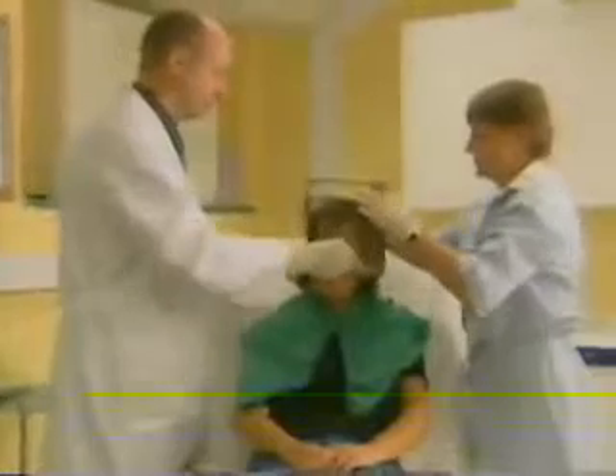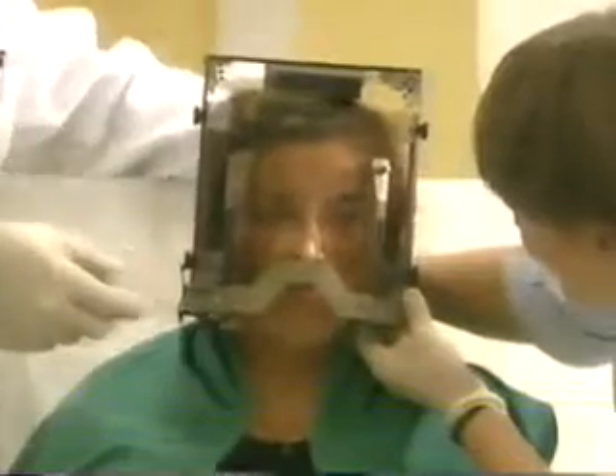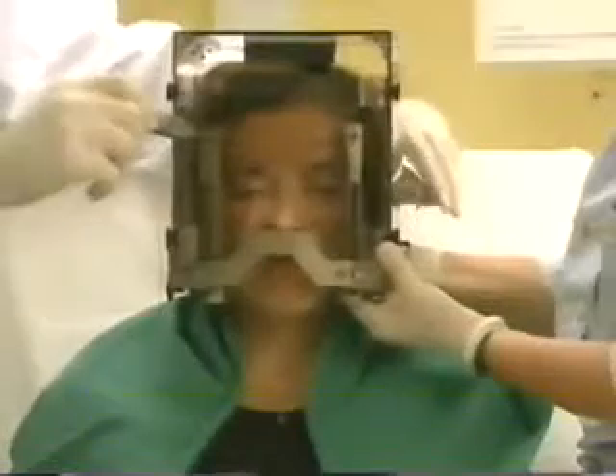Before treatment, your doctor will inform you about the entire procedure. To begin with, the lightweight frame will be placed on your head — your hair doesn't need to be cut or shaved. Local anesthetic is applied where the frame is to be attached, and once the anesthetic has taken effect, the frame will be fixed to your head with four screws. The frame remains on your head throughout the entire procedure to keep your head in a stable position during imaging and treatment. Attaching the frame takes about 15 minutes.